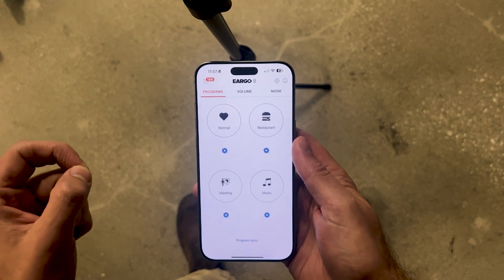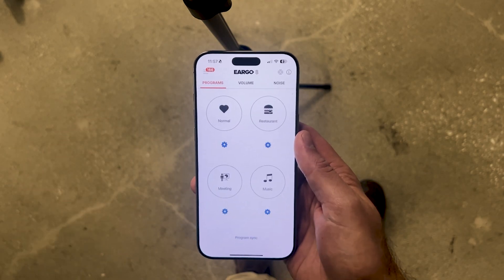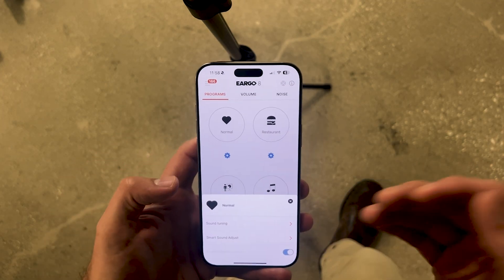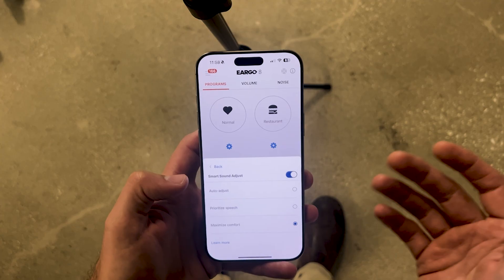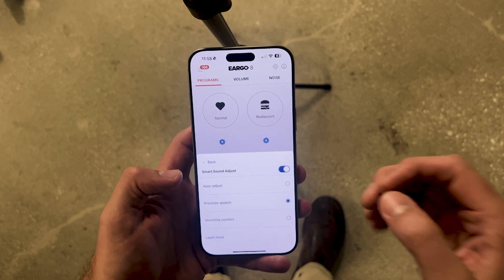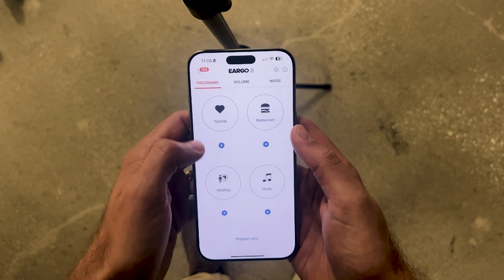The next major tab in the app is the program section, and there's a lot to do inside it. You can access your main programs, but you can also edit those programs. Simply tap on 'restaurant' and in your ears you'll hear the word 'restaurant'; tap 'meeting' and you hear 'meeting'; tap 'normal' and you hear 'normal.' If you tap on the settings underneath each one of these, you have a lot of options to change what that program does. The first option is smart adjust, which lets you switch between auto, a clarity mode for more crispness and higher frequencies, and a maximum comfort mode that minimizes background noise and sudden sounds.